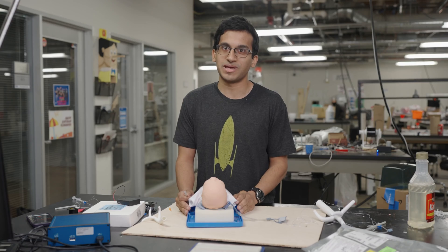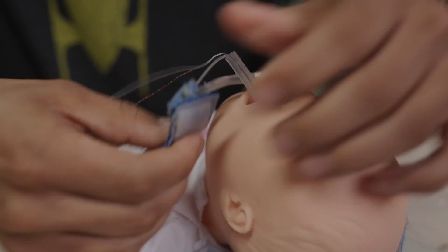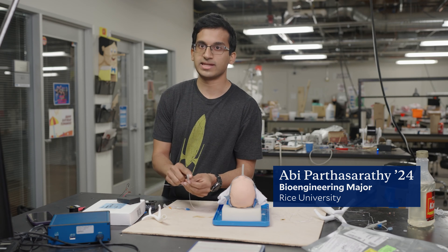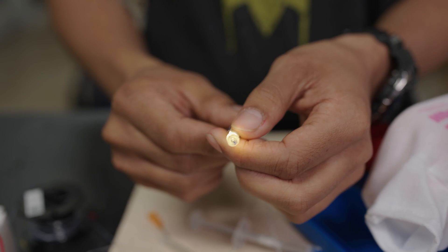This is our intubation baby model. This is our anchoring mechanism that holds the tube in place after it's intubated. This is our integrated camera model with the tube. There's an LED inside, a camera, and a flush port to clear off the camera lens when it gets dirty.